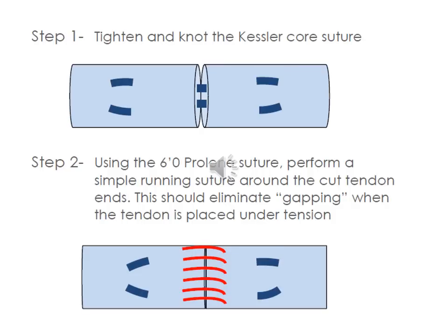Once the knots have been tightened on the Kessler core suture, it is then completed by adding a 6-O proline suture as the epitendinous suture — a simple running suture around the cut ends. This should eliminate any gapping, smoothen the edges, and contributes about 40% to the mechanical strength of the tendon.